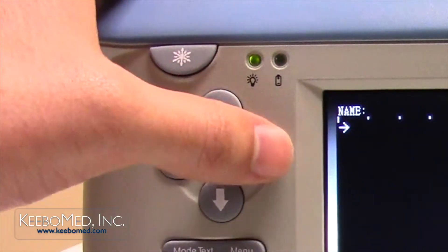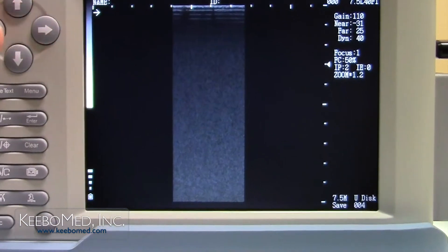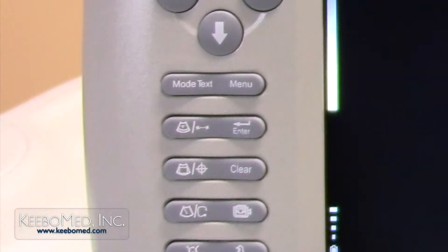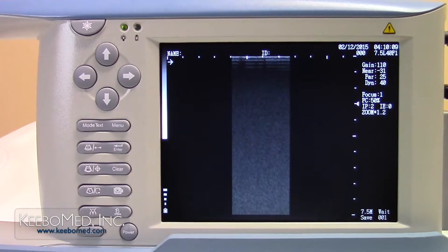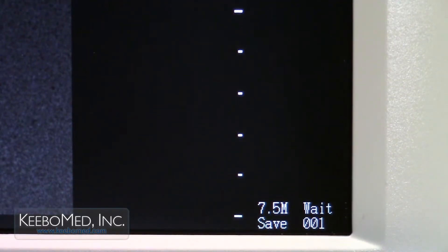Step 4. Press the direction keys to select a specific image code if needed. Step 5. Press the enter key and a wait prompt appears as the image is saving. After the prompt disappears, the current image is saved. An asterisk after the image code will indicate this.